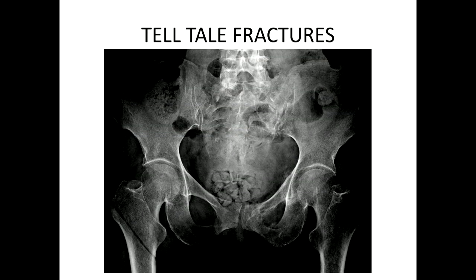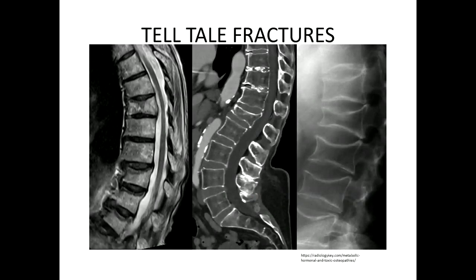The presence of telltale fractures can help raise the concern for osteoporosis. These telltale or insufficiency fractures can occur in characteristic places, such as in the pelvis — seen here in the sacrum, at the puboacetabular junction, the parasymphyseal pelvis, and inferior pubic ramus. Osteoporotic fractures also occur in the spine, where they are seen as biconcave end plate compression deformities early on, which may progress to significant loss of height. Detecting these telltale fractures is very important and should prompt an evaluation of the patient's bone mineral density.